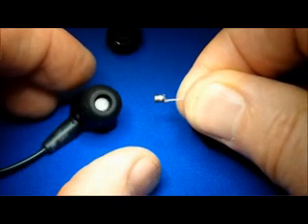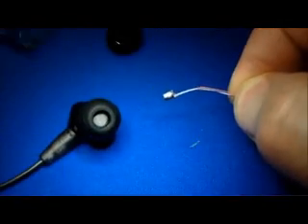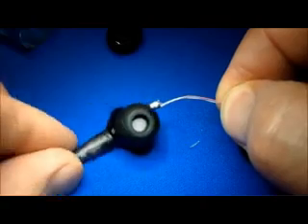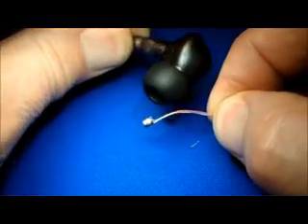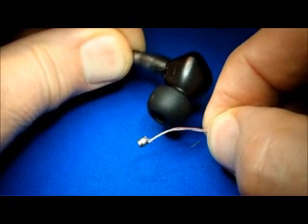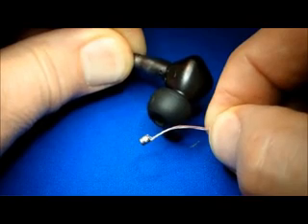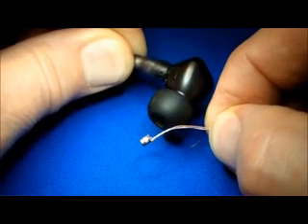In the Stapedius reflex measurement that we're going to make, we're going to insert a small probe microphone into my ear canal, followed by sealing the canal with this particular construction. This will allow sounds to be created in the canal and the resulting sound pressures to be measured.